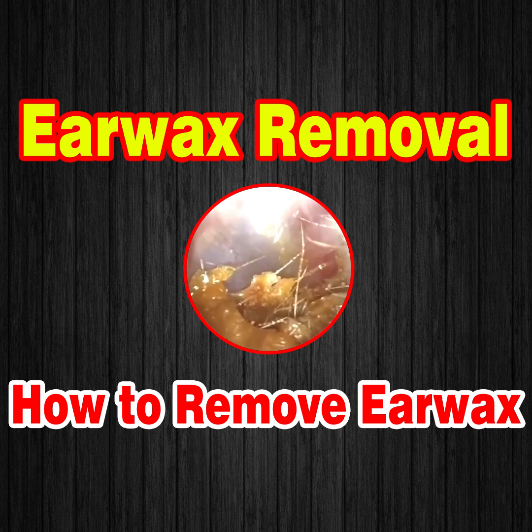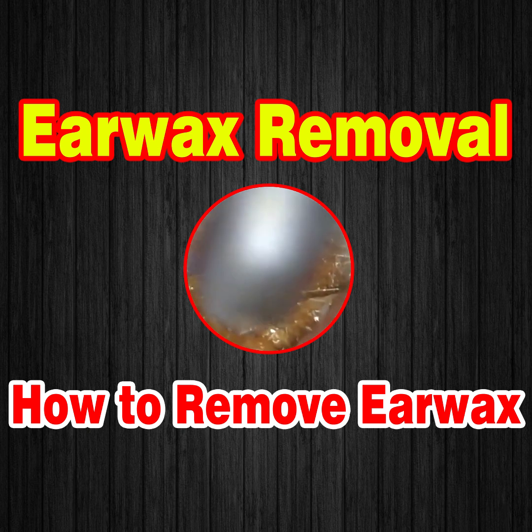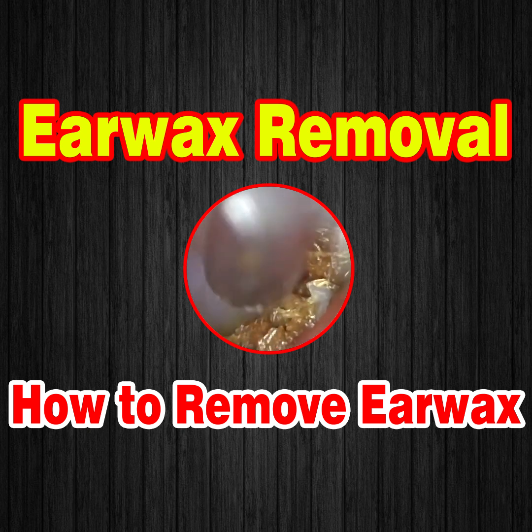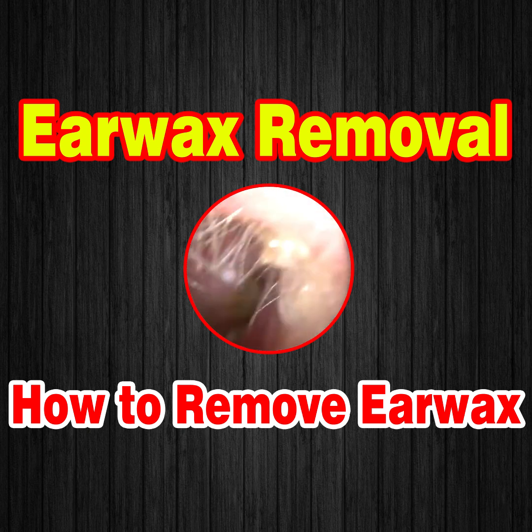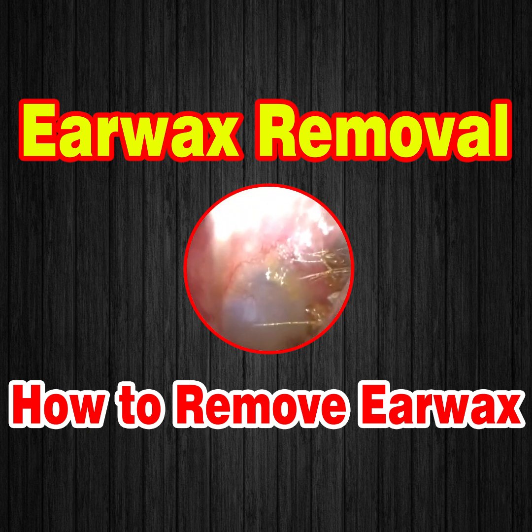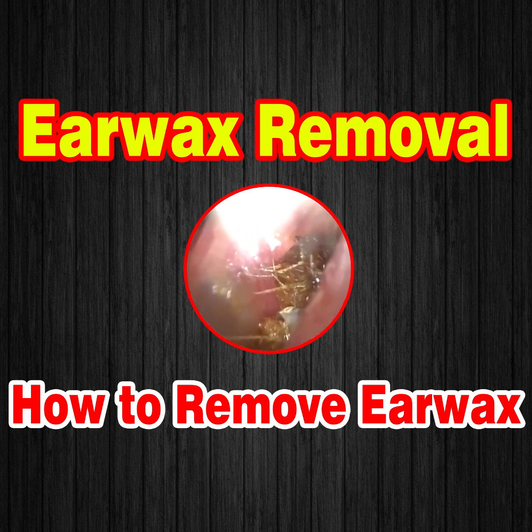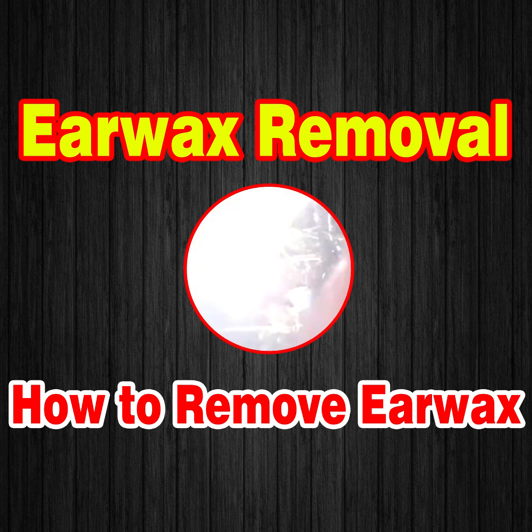So when you use a speculum, you can stretch and straighten the cartilage portion of the ear canal because that's malleable, it's flexible. You can't do that with the bony part, so hence why for me the endoscope still is number one. But in cases like this, with the wax, you can remove the majority of the wax. The patient was able to hear very well at this stage even, but I wanted to get this out. I have a feeling this has been there for a long time because, as I mentioned earlier, they previously underwent a procedure and had to abandon it because it was very painful for them.